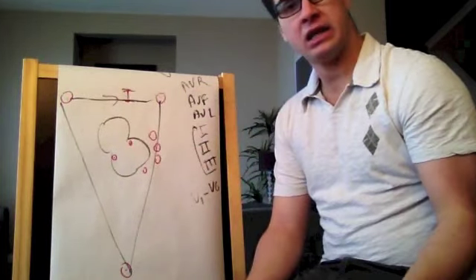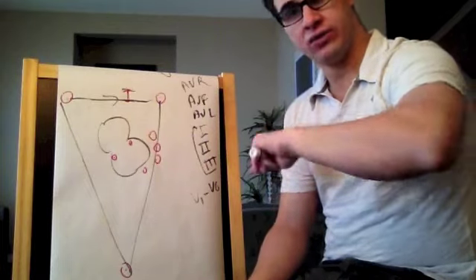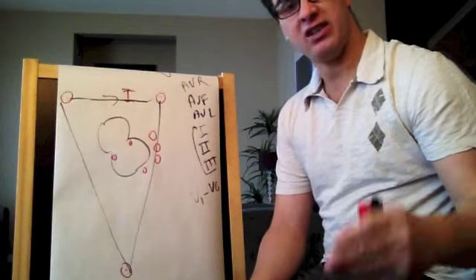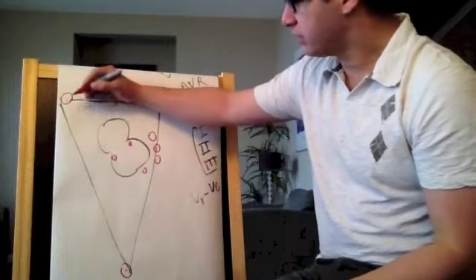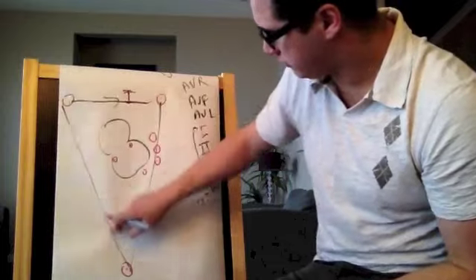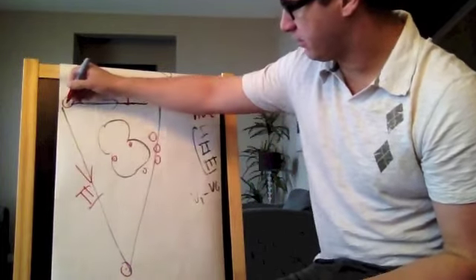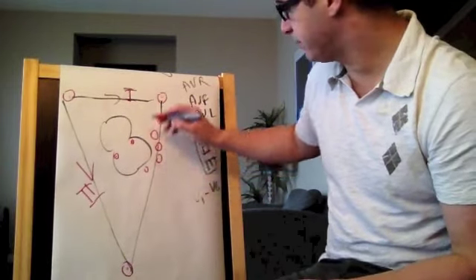Is it the best one? Maybe 90-95% of the time, and we'll talk a little bit more towards the end. There are cases where it would be a good thing to read other leads, and we'll see why. So my lead 2 reads it this way. So we'll take this one here. So that's lead 2. That means the electricity from this one to this one, but actually it's more on an axis like this.